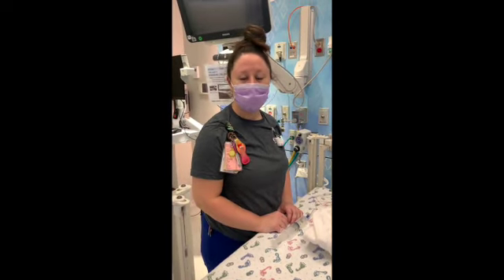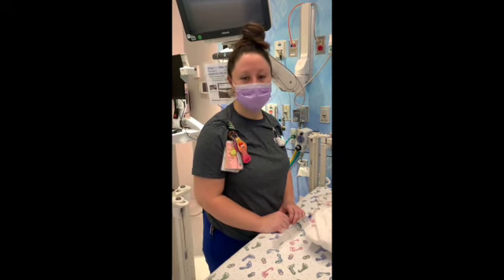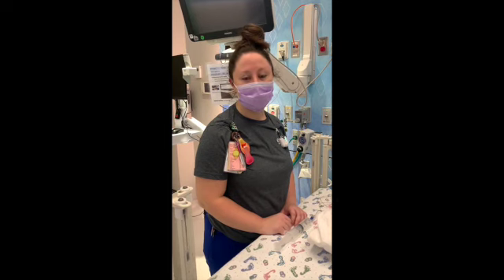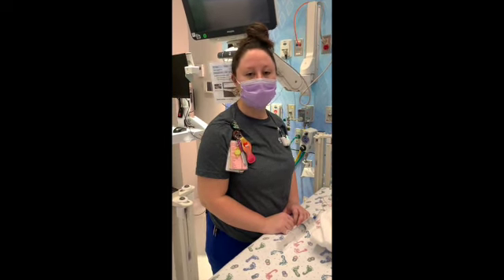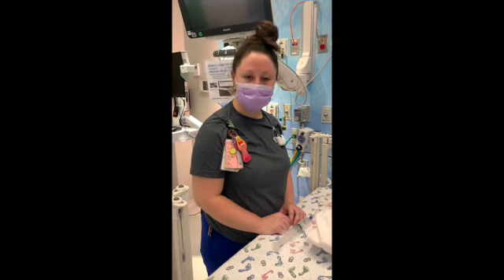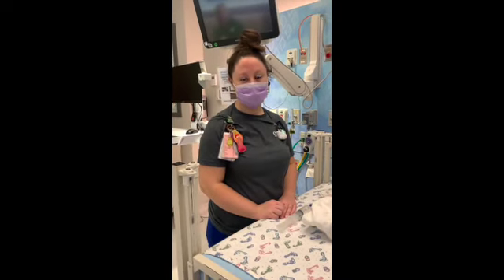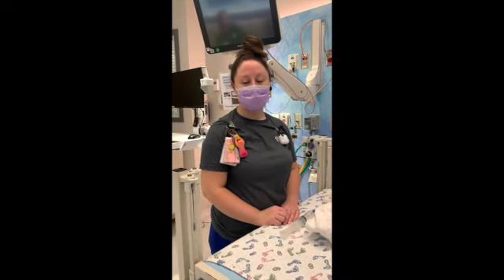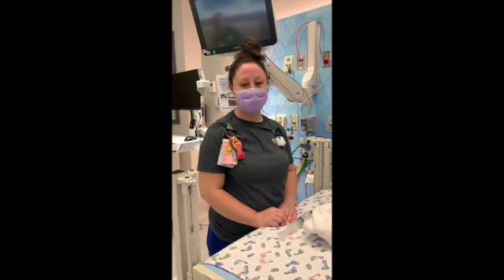Here is some helpful information if you are caring for a patient on the jet or an oscillator. Our policy states that we will be suctioning their tube PRN, but it's hard to know what this truly means. So if you have any change in your patient, in their TCM, your gas is looking poor, or they have an increased oxygen need, coordinate with RT and see if they need to be suctioned. It should be done at least once a shift. Another thing to assess if your patient's on the jet or the oscillator is their jiggle. They need to have an adequate jiggle to make sure that we are oxygenating and ventilating them appropriately.